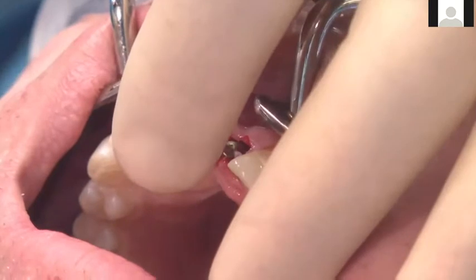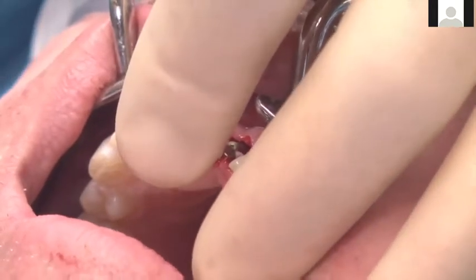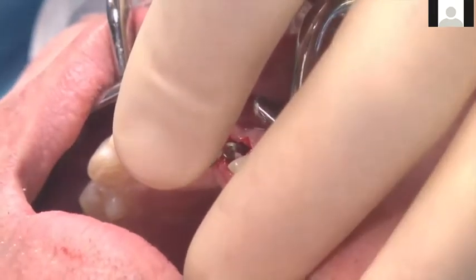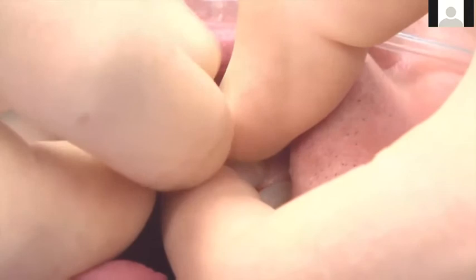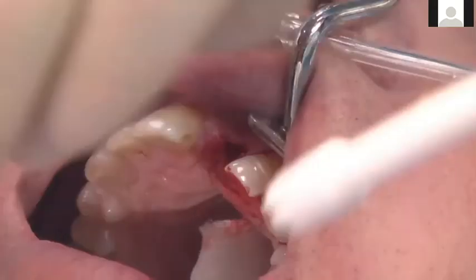It's important to put a piece of gauze so that it doesn't fall down here and the patient aspirates it or it goes down the patient's throat. So always use those safety or security measures. Also, as you can see here, I typically put my finger behind it, behind that pin, so that once I unscrew it, I don't unintentionally drop it, because especially after we use these a couple of times, they will sometimes drop out of that driver. So very carefully take it out so you don't drop it.